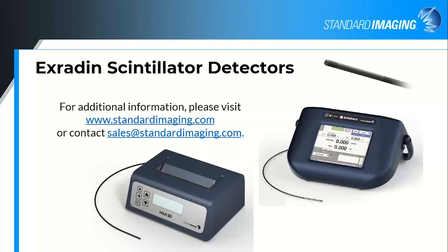How often is it necessary to recalibrate? Generally, the signal degradation that we see is you get about 2% decrease in signal for every 1,000 gray that you deliver to the fiber. And so you would want to recalibrate probably about every kilogray for the dose characterization. And then for the Cherenkov, I don't think that decreases quite as quickly, but I would check it maybe about that same frequency and make updates if needed.